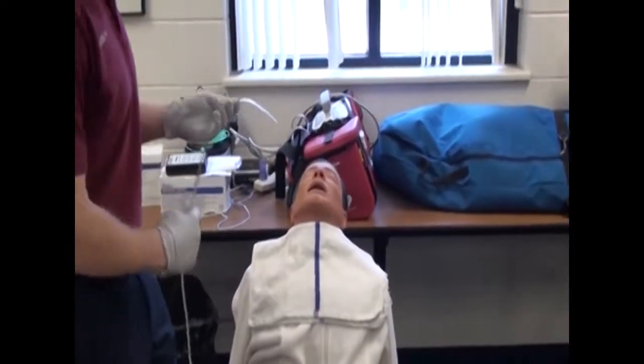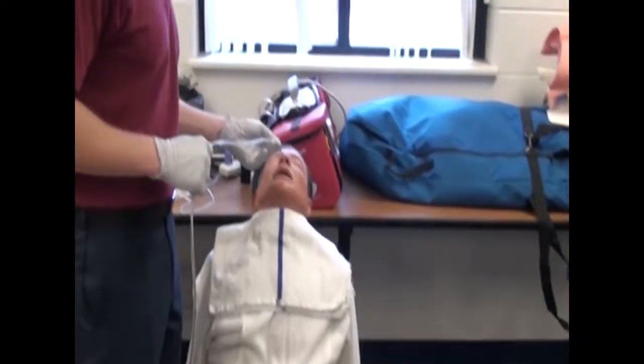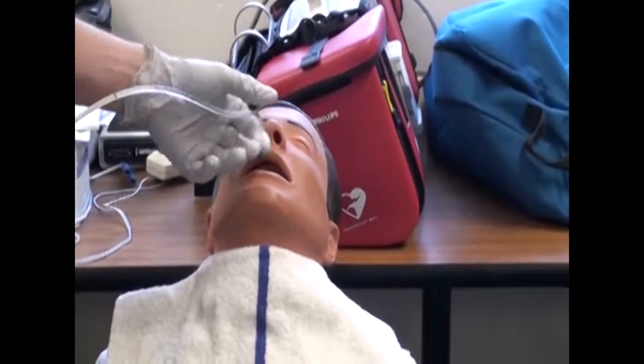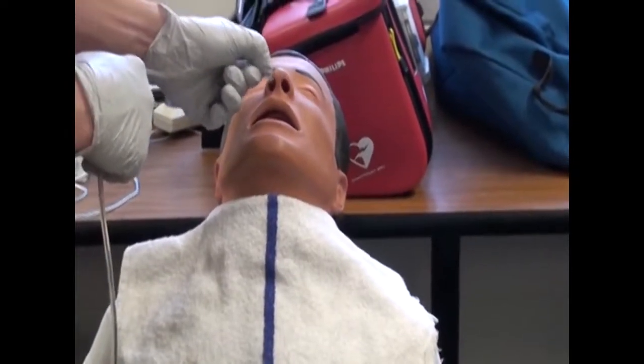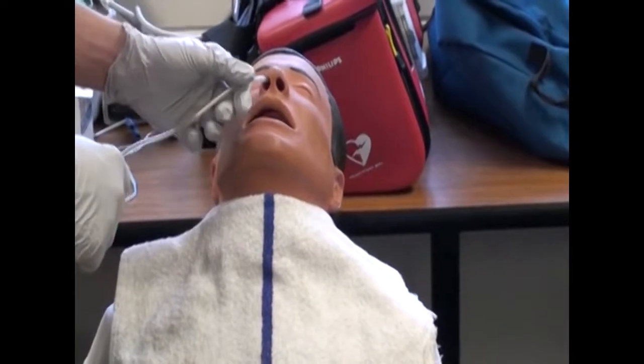Insert tube slowly through nares with curved end pointing downward. Pass tube downward, applying gentle pressure to advance. Use other nares if resistance is met. Insert just past narrow nasopharynx with gentle rotation toward opposite nares. Stop advancement and allow client to relax.